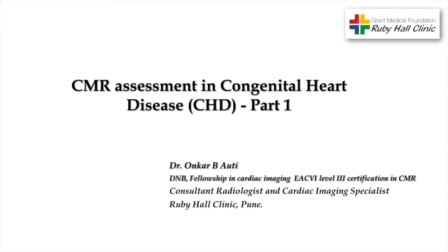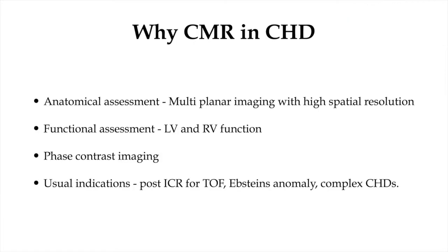Hello everyone, I am Dr. Onkar Auti and I am going to discuss CMR assessment in congenital heart disease, part 1. Why are we doing cardiac MR in congenital heart diseases? As we know, cardiac MR is multiplanar imaging and has a very high spatial resolution in cardiac imaging. So it gives us very good anatomical details in congenital heart diseases.